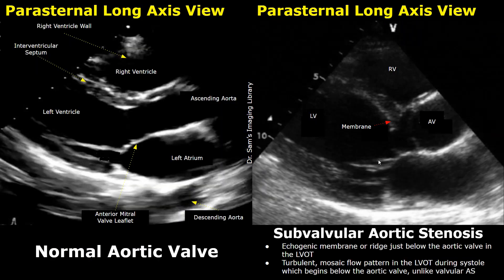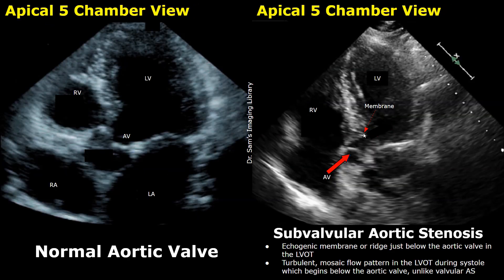In subvalvular aortic stenosis, there is a small membrane present just below the aortic valve. It is a congenital condition. An echogenic ridge-like structure will be seen just before the aortic valve on echocardiography. This membrane can cause aortic valve stenosis. Subvalvular aortic stenosis can also be seen in the apical 5-chamber view as an echogenic ridge near the aortic valve. Normally, this ridge is not present — it is a rare condition.